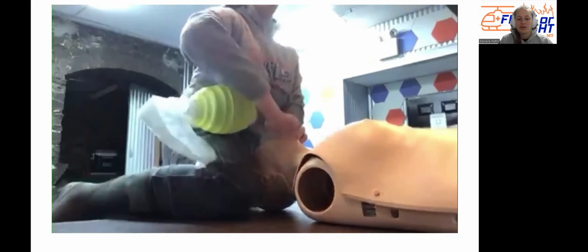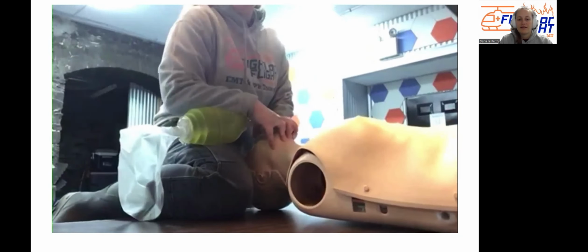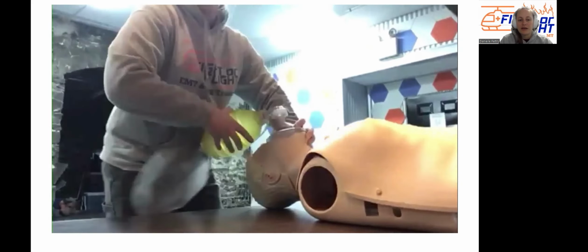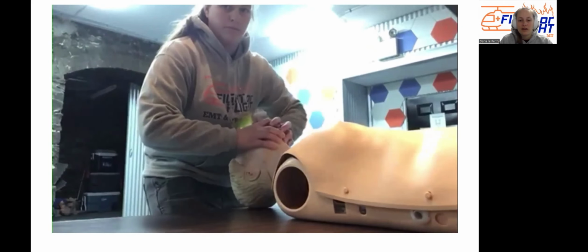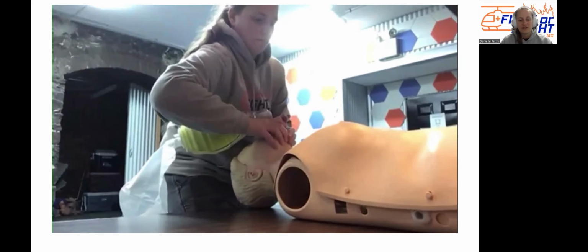You can also put your leg beside the patient and push with your chicken wing into the leg, making sure that head's tilted back, having 2 hands on the mask to maintain the proper seal. So these are both acceptable ways, using this chicken wing or having your leg beside the patient's head and squeezing into there, if you can get good chest rise. So this is something you're going to want to practice before you do it for real in the field. So if you want to give that a shot, that's just another thing you can try out.